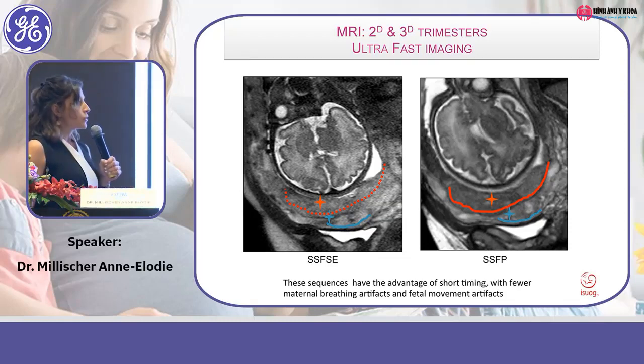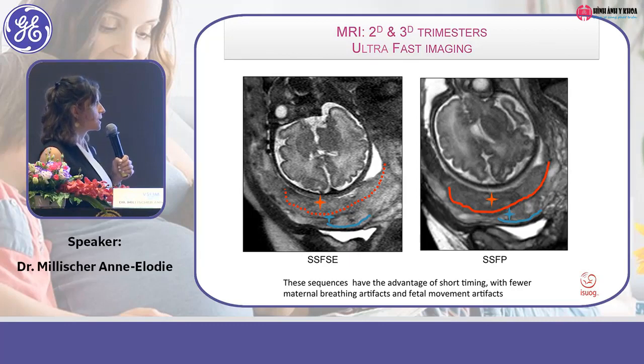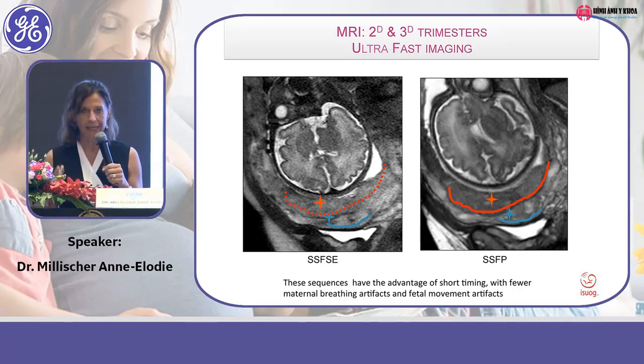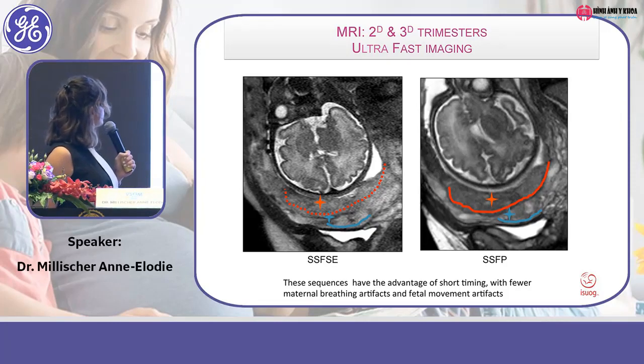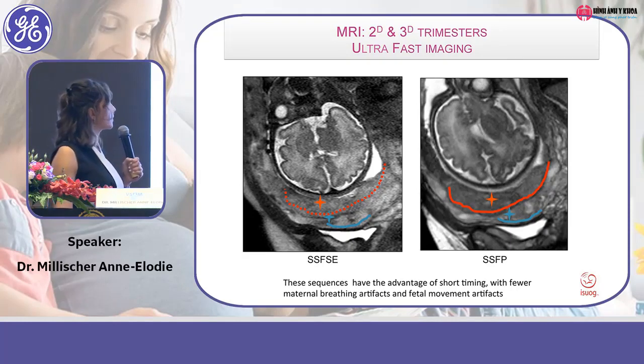The recent literature offered some kind of guidelines to correctly assess a placenta during your daily scanning. Đây là một cái bảng khuyến cáo các bạn nên đánh giá một cái bánh nhau một cách hệ thống trong những lần mình siêu âm thường quy.